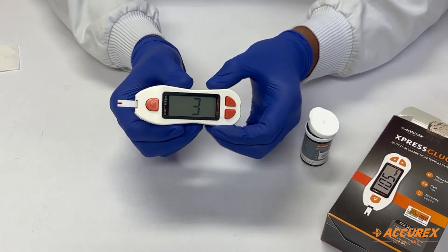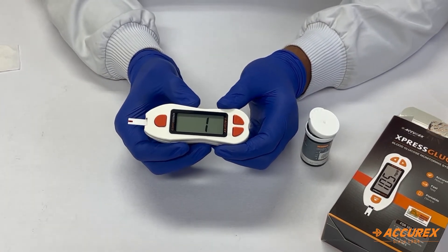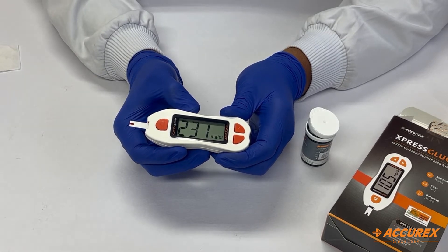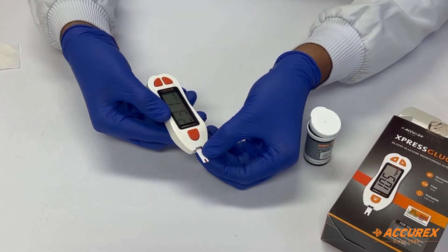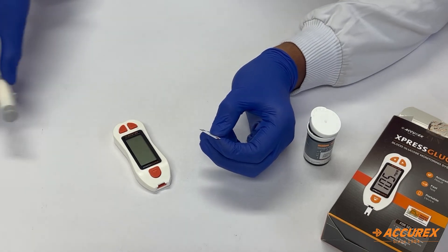Now we have to wait just five seconds to obtain the results. As you can see, the results are displayed. After testing, the strip should be discarded properly and the lancet should also be discarded properly.